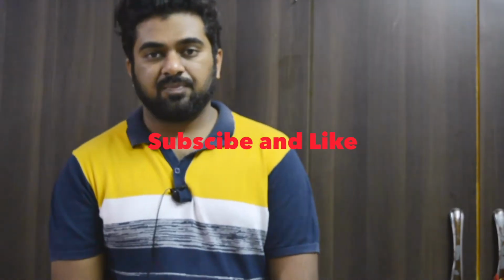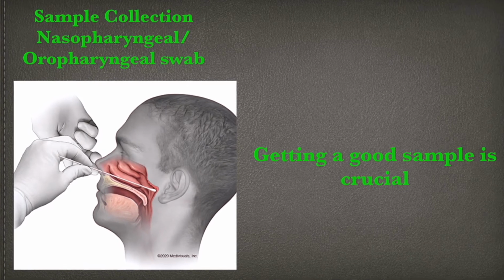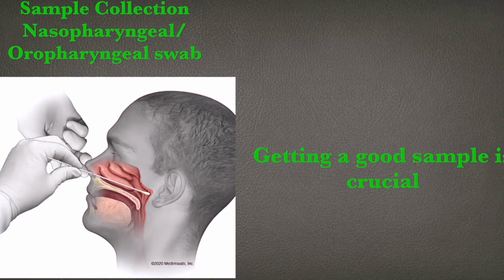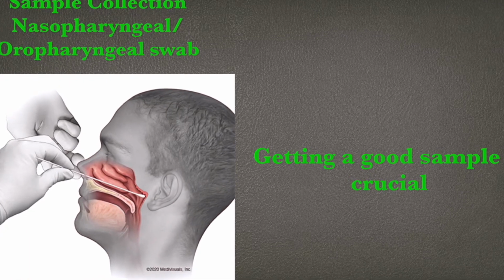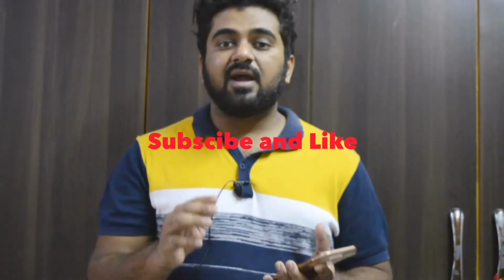Diagnosis of COVID-19 can be done by two methods. One is PCR, that is polymerase chain reaction, and another one is rapid blood testing kits. So first we'll discuss the PCR. Now to perform the PCR, first we need to collect the sample, and the sample is collected from the nasopharyngeal and oropharyngeal swab. During this step, collecting a good sample is very crucial, because if we do not collect a proper sample, then there won't be enough virus load on that sample, and that can lead to a false negative result. So collecting a good sample is very much required.